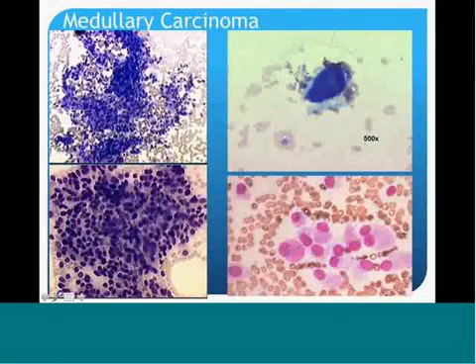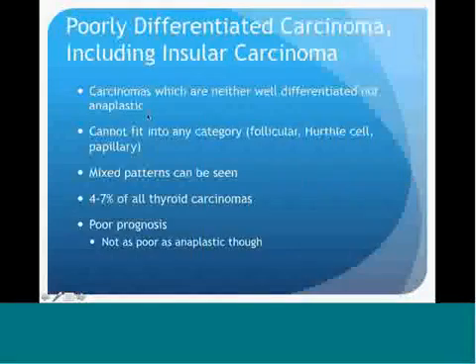So here you have the many pictures of medullary carcinoma. See, it looks like a spindly aspirate. And the nuclei are kind of elongated, sometimes cigar-shaped, sometimes plasmacytoid. In this picture, you have these red granules that are apparent in the cytoplasm, and they can also look a little smudgy like this. But for the most part, this can be amyloid, and the nuclei are very disorderly and discohesive.